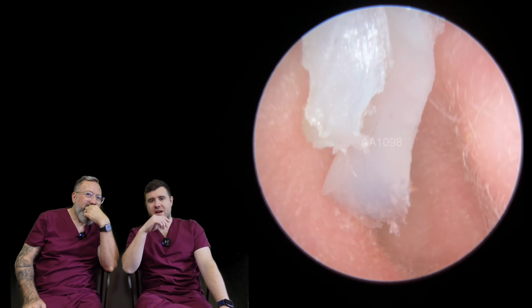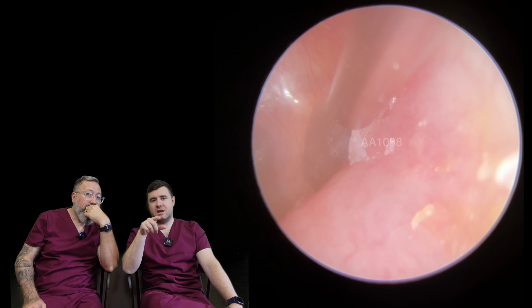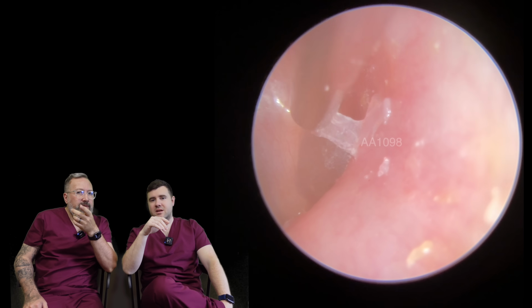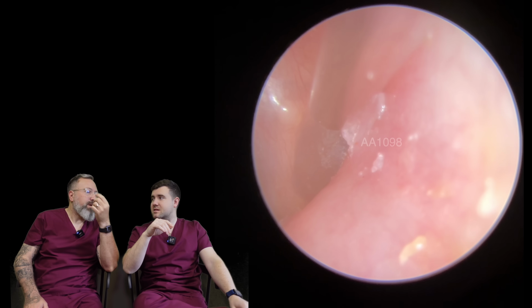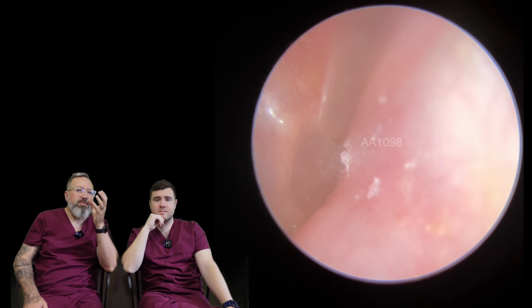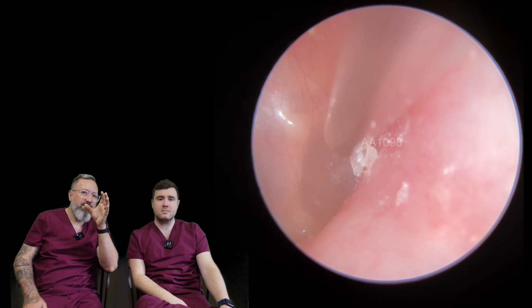See, that's quite scary, because if that wasn't an endoscope that you were using there, someone probably would have said that was looking okay. Not okay, but something didn't look quite right. But I think you could have quite easily mistaken that for tympanosclerosis or something like that. Do you know what I mean? Looking at it, but this is the beauty of the endoscope. This is why we love using the endoscope. It just gives you such a fantastic view.